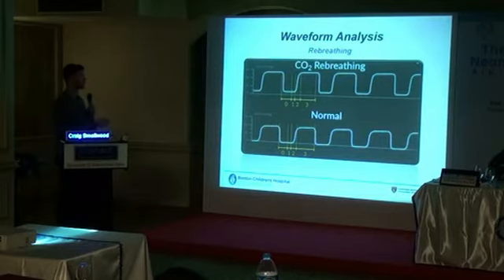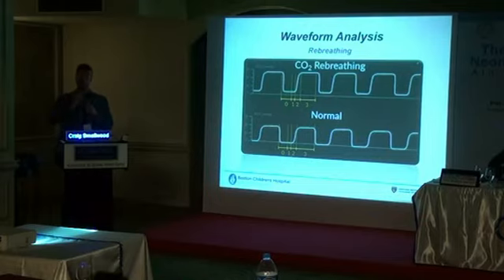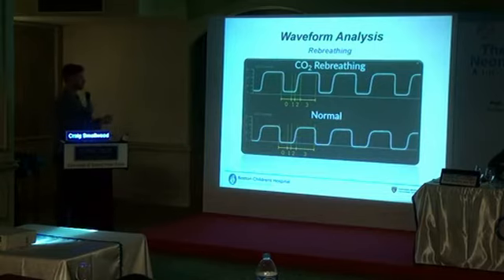If you don't give yourself enough time between the breaths, you could be leaving a little bit of CO2 in the mechanical dead space, the portion of the ventilator circuit that may have CO2 in it, and you inhale it during the next breath. The way it looks is basically just an elevation above baseline.